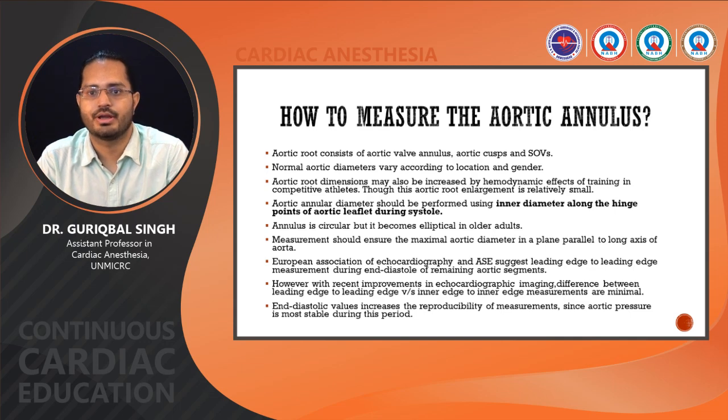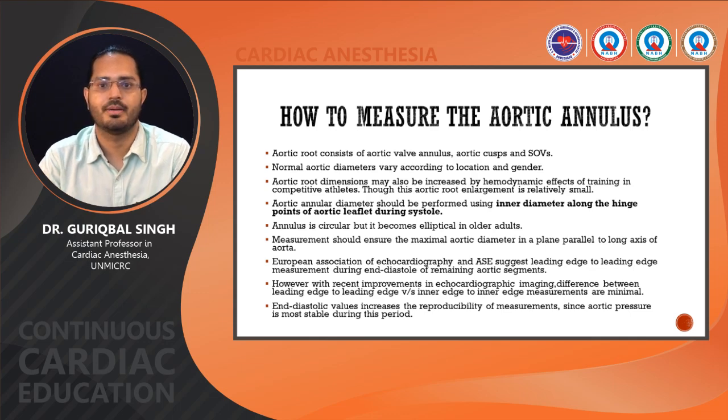The European Association of Echocardiography and ASE suggest leading edge to leading edge measurement during end diastole for the remaining aortic segments. However, with recent improvements in echocardiographic imaging, the difference between leading edge to leading edge versus inner edge to inner edge measurements is minimal.